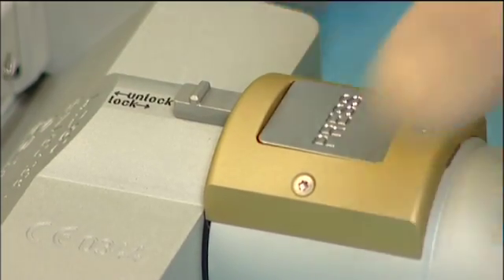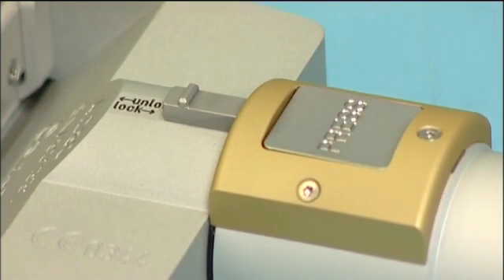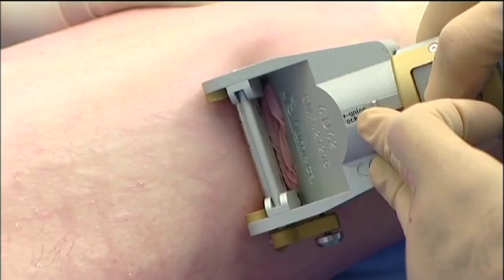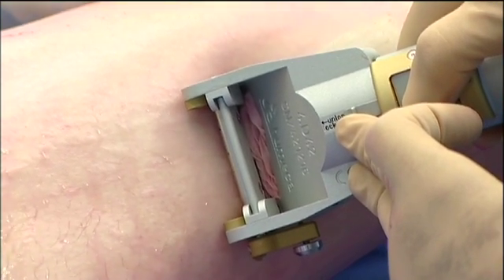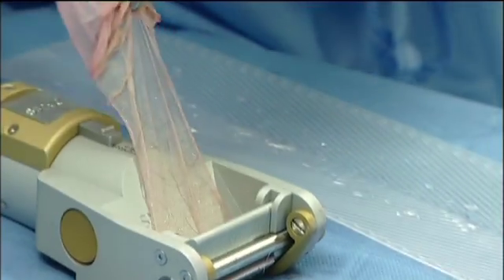To check proper operation, the main switch is pressed. The dermatome is now ready for use. Here, a D42 dermatome is used to harvest a graft from the upper leg of a male adult patient.